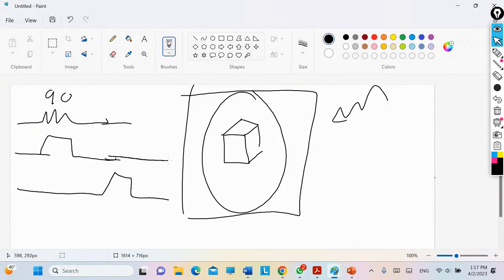Didn't we work, for example, with spin echo, giving 90 and then giving 180, and then you receive your signal? So with the 180, apply another gradient but in the y direction. It's like this is in the x and this is in the y, as if you did slice selection but in the y direction. So, in this case, how will my slice look?